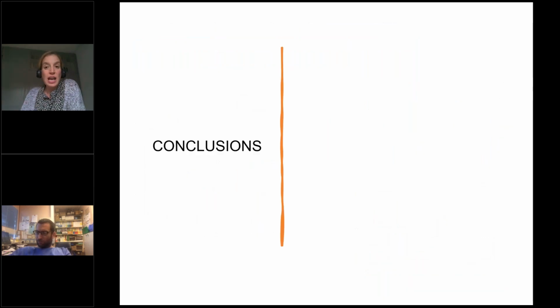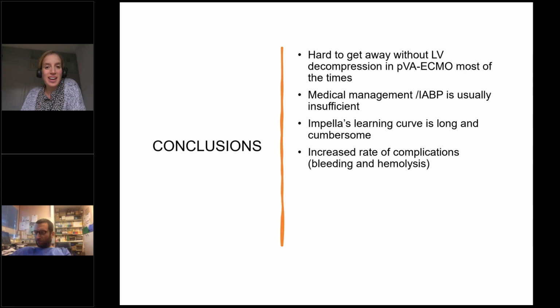So conclusions, I brought a few. I'll start with the negative ones. It's hard to get away usually with just medical treatment or a balloon pump in patients that need peripheral VA ECMO with very bad LVs. The medical management is usually insufficient. The Impella learning curve is long and cumbersome and sometimes really frustrating. And there's an increased rate of complications. Mainly, I think nowadays that we do a lot of it, we see a lot of minor bleeding from the insertion point and hemolysis related to either clotting of the pump or a suction event.